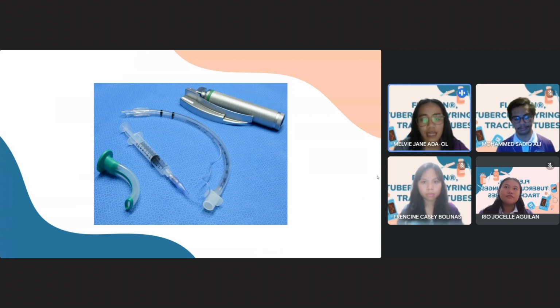The PVC that has been siliconized helps suction catheters slide through the tube. Before, rubber was utilized to make this, which allowed for reuse following cleaning and autoclaving.